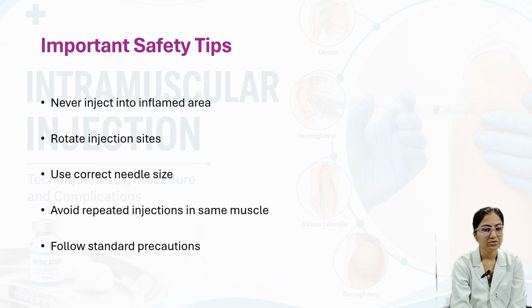And then here we'll see important safety tips. Never inject into an inflamed area, and then rotate injection sites, and then use correct needle size. Avoid repeated injections in the same muscle, and then follow standard precautions. These are the important safety tips.